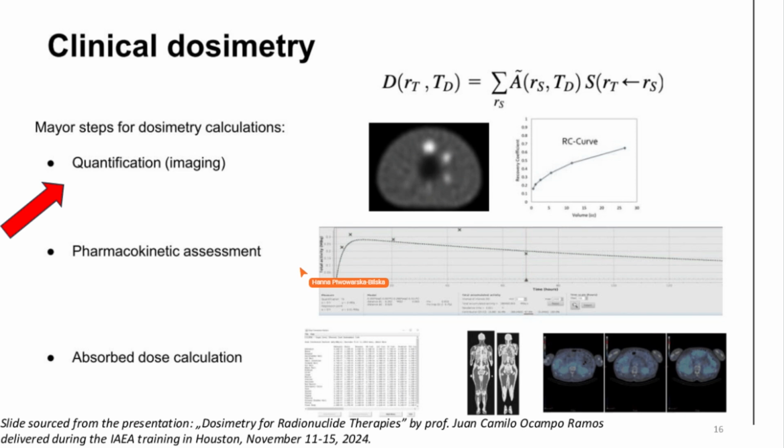The next step is the calibration and harmonization of the apparatus used. So sensitivity measurements, looking at the counts of the gamma camera, and appropriate data have to be downloaded. Then you have to check whether the dosimetry program reads the information from the gamma camera.